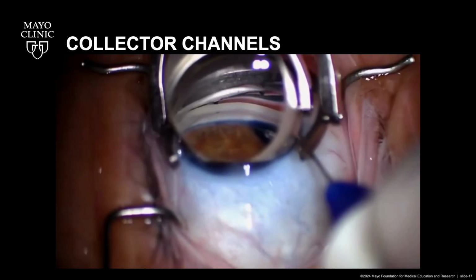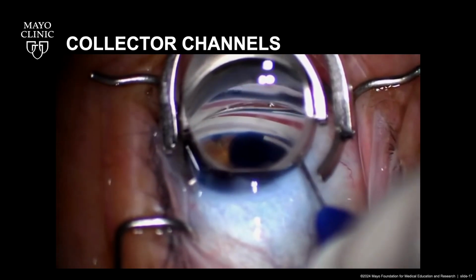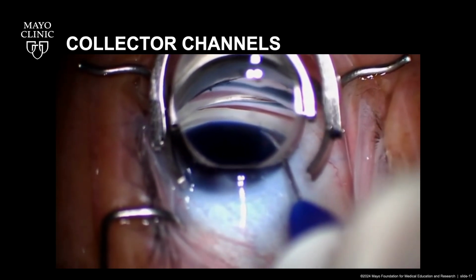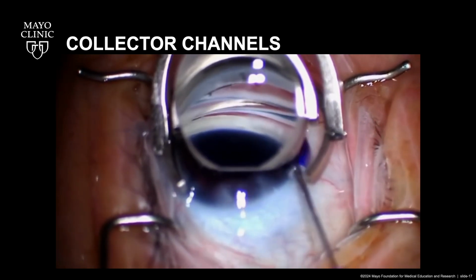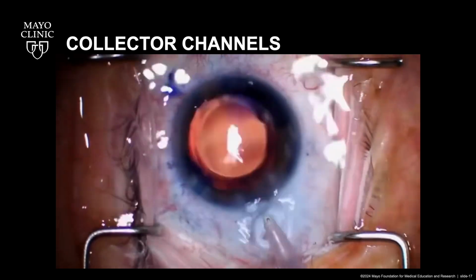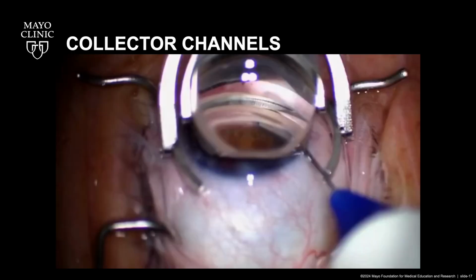In this step here, we see the injection of trypan blue into Schlemm's canal, and as it seeps out of Schlemm's canal into the collector channels, we see some of the sclera turning blue. This tells the surgeon that the canaloplasty was done adequately, Schlemm's canal was properly dilated, and collector channels were opened. This allows for the outflow of the trypan blue dye into the collector channels, and thus we can see that blue stain in the sclera area.